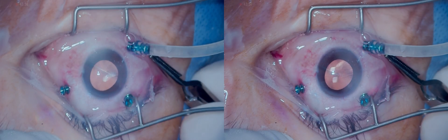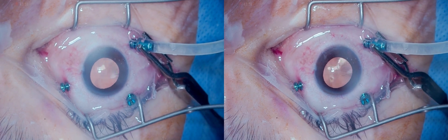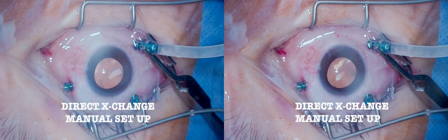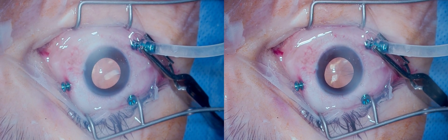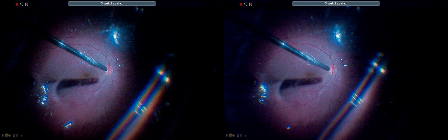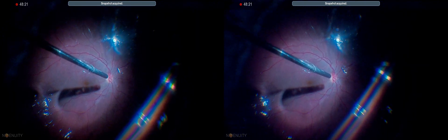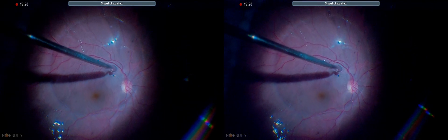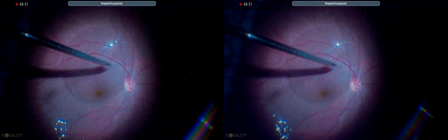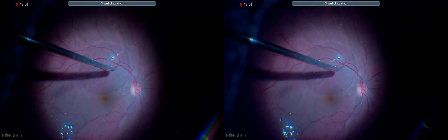Switching to the other side, the same laser is applied but less intensely. A direct exchange from perfluorocarbon to silicone oil is then set up manually. A bulldog clamp is used to secure the tubing at the sclerotomy incision sites and at the syringe exit. The injection is performed very slowly to prevent any retinal movement during the exchange. The last droplet of perfluorocarbon is carefully removed — a good visualization system always helps.